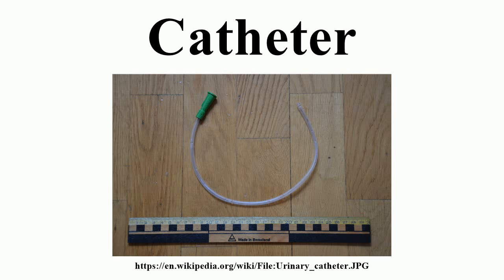It is also very useful in cases of urethral fistula. A simple procedure such as dilatation of the urethra and passage of a Gibbon catheter often causes the fistula to close. This catheter is also of use in the treatment of urethral stricture and, as a temporary measure, in the treatment of retention of urine caused by carcinoma of the prostate.